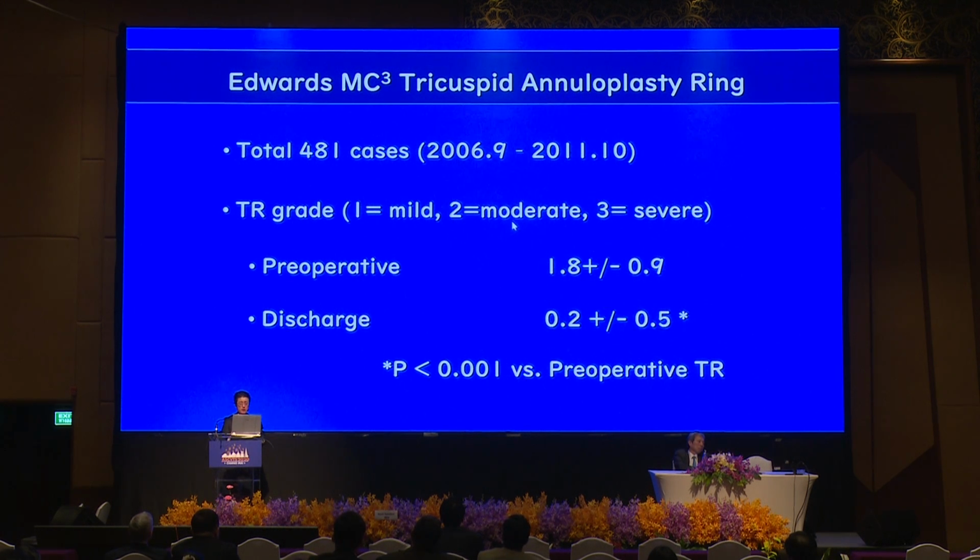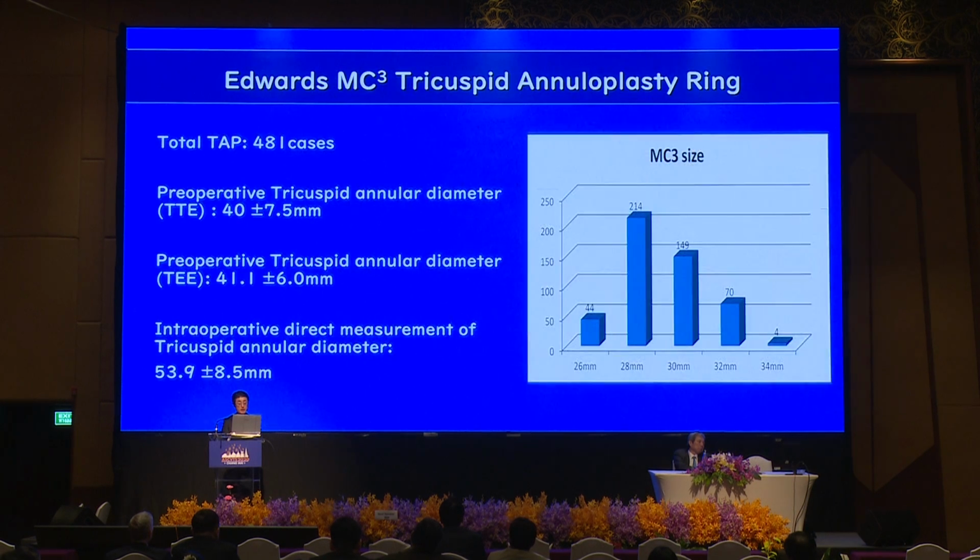The significant TR was nicely treated with the 3D rigid ring.